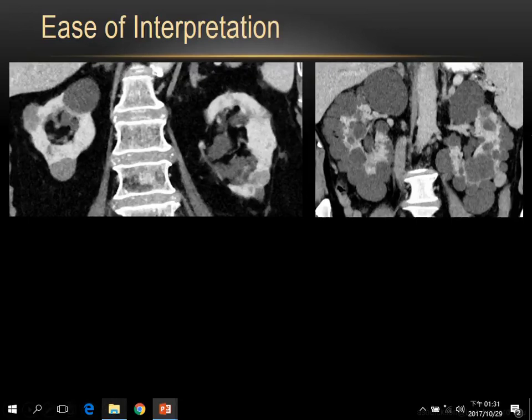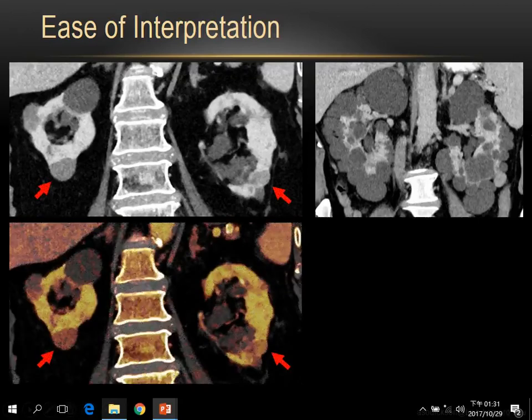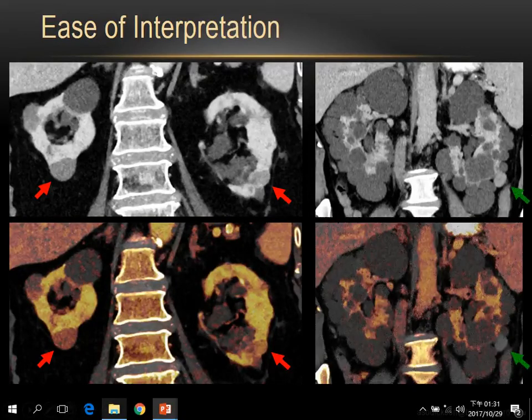We traditionally have a non-contrast scan and a post-contrast scan, and they're never perfectly registered. We often have to place a region of interest and try to match the location in another image. Here, with dual energy CT, the iodine information is inherently co-registered perfectly with the non-contrast imaging, and you can see that we have enhancement within these lesions. These are enhancing masses, whereas this patient has a non-enhancing hyperdense cyst. This makes it so much easier to read these types of cases.